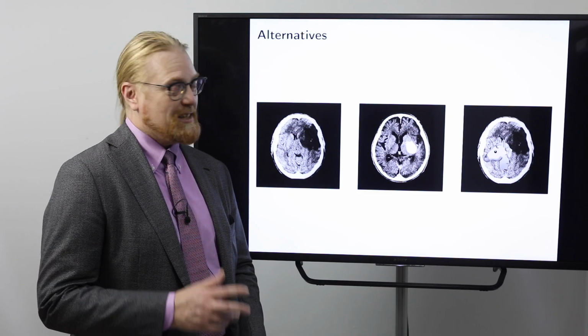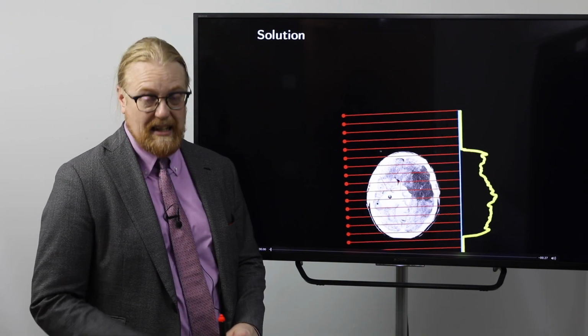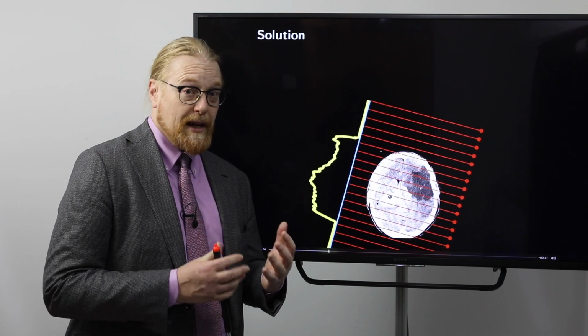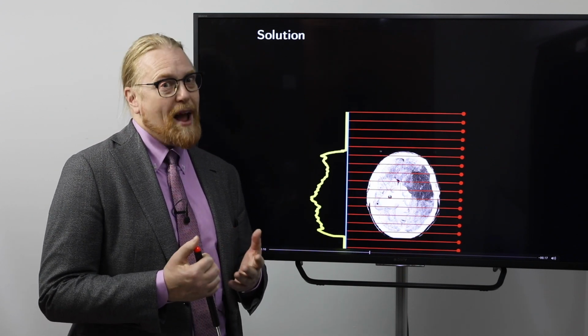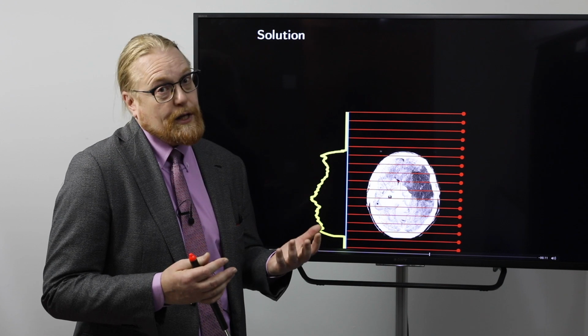Well, you might already get a hang of my sense of humor, so actually it is unicornism. And at this point I would say that of course these three options do not make any sense. In practice there is something inside the scanner, we get some data, we don't get any three choices.